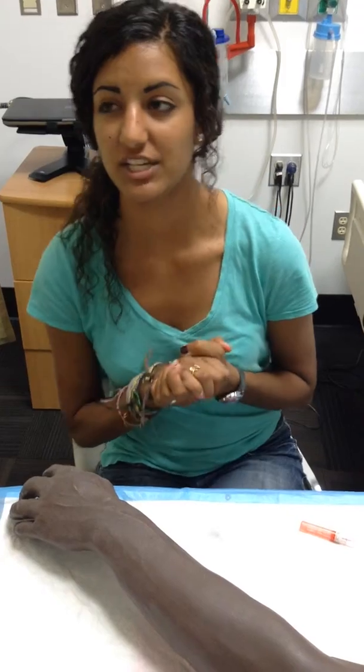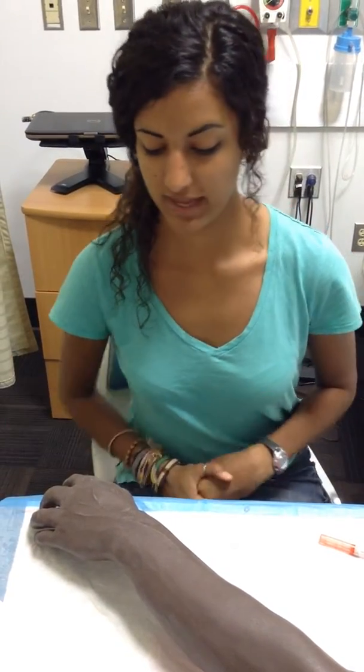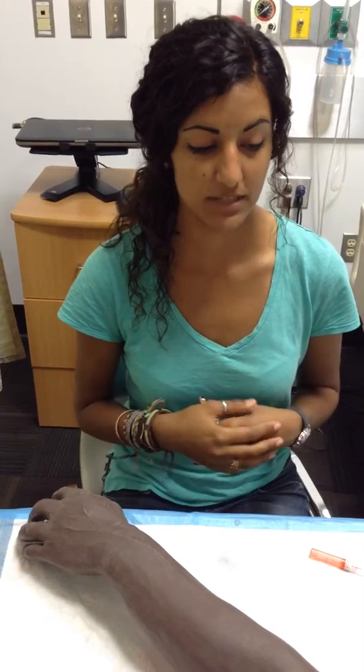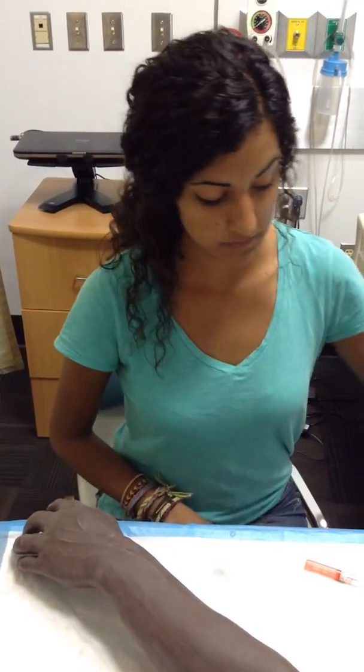I perform hand hygiene and I'll provide privacy for the patient. I'll introduce myself and ID the client. So you might tell me your name and date of birth. That checks. I'll look at the physician's orders, explain the procedure to the patient, ask any questions that they might have. And I will have my supplies prepared.